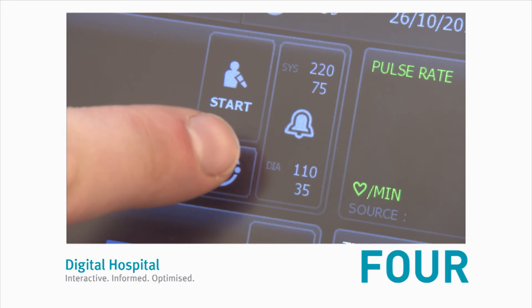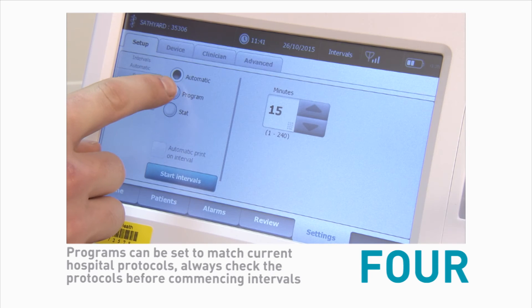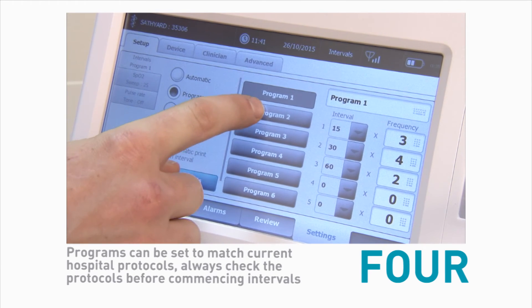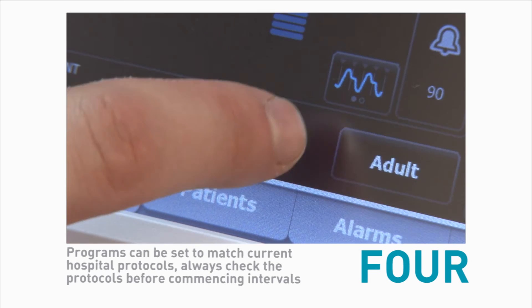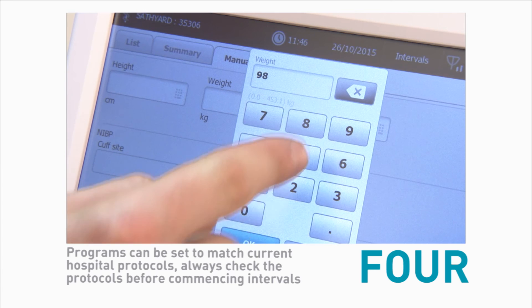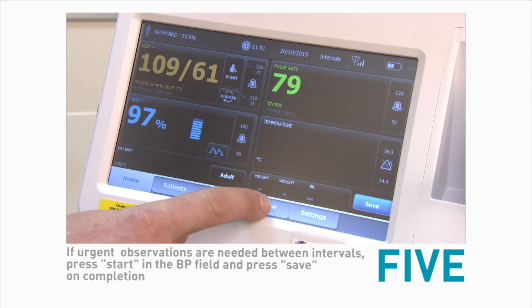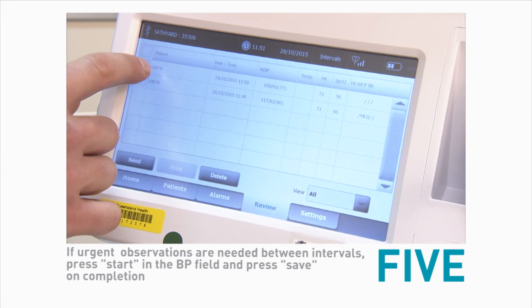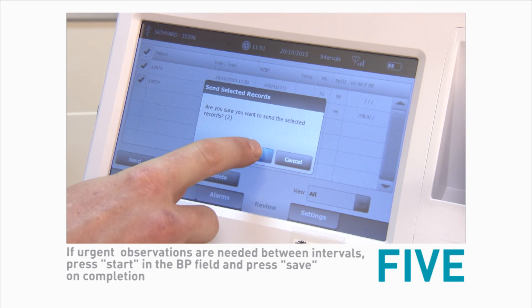Number four, now we set the intervals. Touch the clock icon in the BP area and select automatic or program observations. Press start intervals. Enter any manual observations or modifiers by touching the modifier box. Leave the BP cuff and O2 SATS probe on the patient. Number five, at the completion of each interval, press the review tab and select the observations as transferred to the EMR and press send.